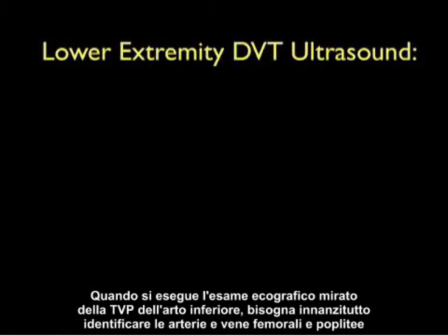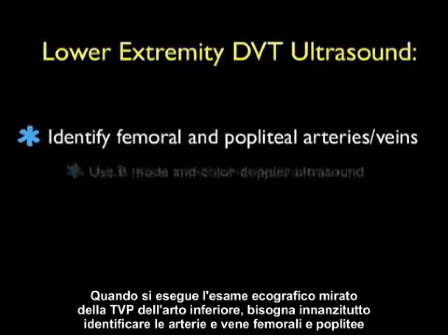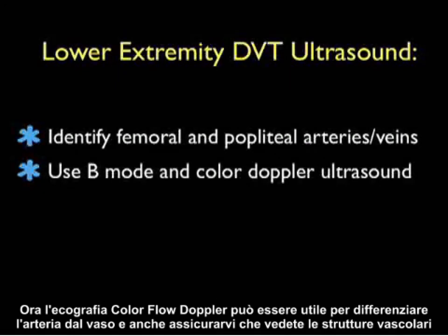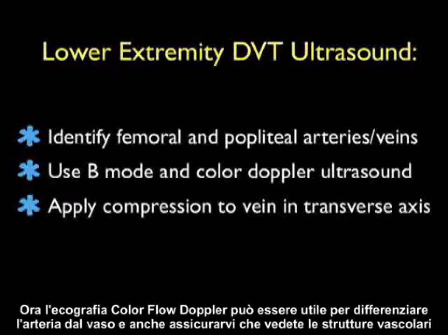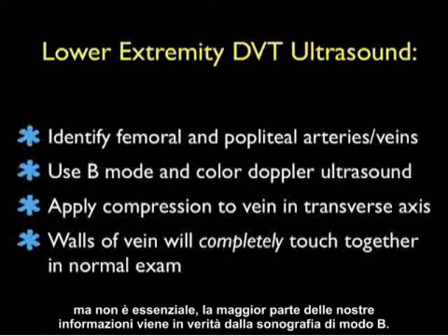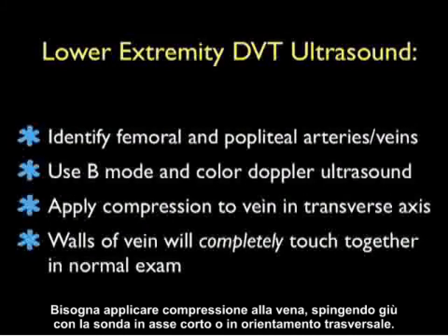When performing the focused lower extremity DVT ultrasound examination, we want to first identify the femoral and popliteal arteries and veins using B-mode or grayscale sonography. Color flow Doppler ultrasound can be helpful in differentiating the artery from the vein and also making sure that you're looking at vascular structures, but is not essential. Most of our information will actually come from B-mode sonography.